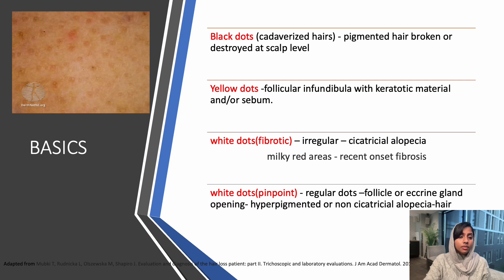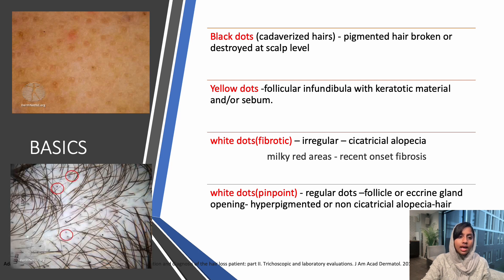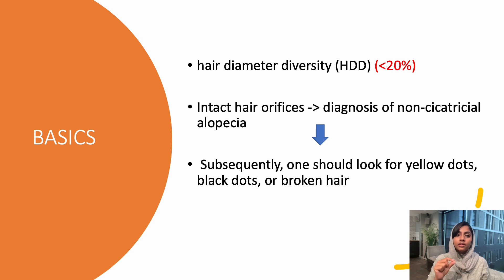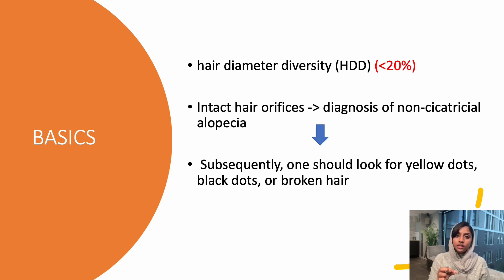These are the dermoscopic images of yellow dot as well as a black dot. Another important factor is hair diameter diversity. In a normal scalp, there will be a variation in hair diameter of less than 20%, but in a pathological condition this goes to more than 20%.